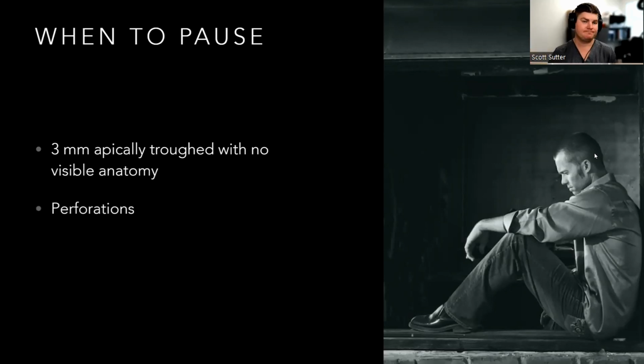If you perforate, repair it, let the patient know. But after you perforate, no one's in the right mindset to go find anything after that. Let the material set up, go take a cone beam. You'll know where to go after that. I have a case that I'll post eventually where I could not find MB2, completely calcified case, perforated, repaired it. She came back a month later, and because I had the cone beam and wasn't an hour into the appointment, it was very easy to find MB2 and complete the case.